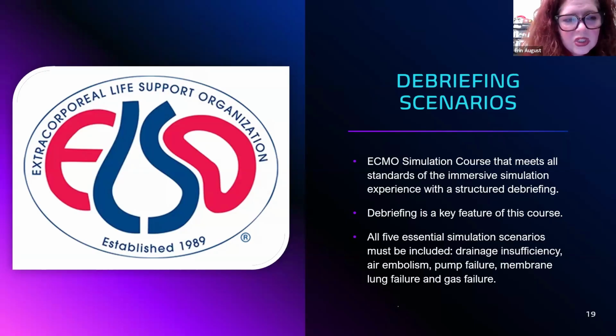So if I have a circuit change, well, let's talk about it. Let's debrief on it. What worked, what didn't work, what else might I need to add into my wet lab or situation next time based on my feedback and my debriefing on the actual situation that I've gone through, whether it's de-airing, cutting a new circuit, primary pump failure, all these things. Again, it only makes us better. It makes us faster and more efficient.